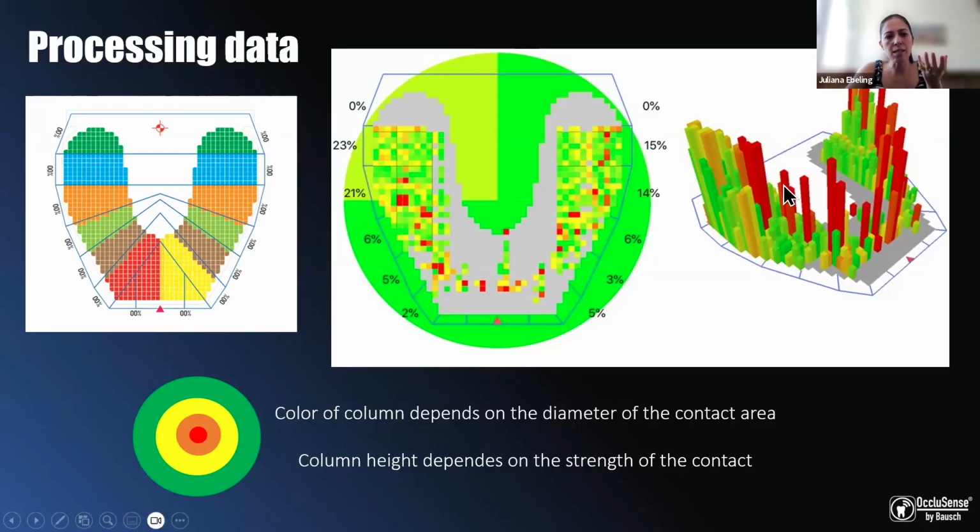When I'm adjusting a rehabilitation, for example, I'm looking to reach the red columns, and the same intensity between the posterior teeth, with lower contact intensity in the frontal teeth, and then in the movement, we change these dynamic contacts. Okay? Until here, it's okay?